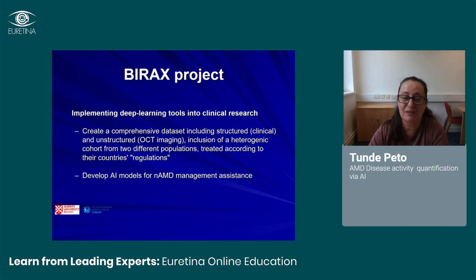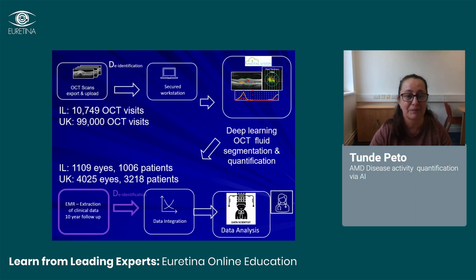You can see how this cohort would really resonate with all of those issues that Marion has been speaking about, and how we can develop AI models for helping to manage AMD. We had over 10,000 visits in Israel and close to 100,000 visits here in Belfast, and you can see how many eyes and patients.